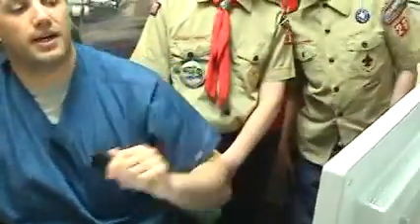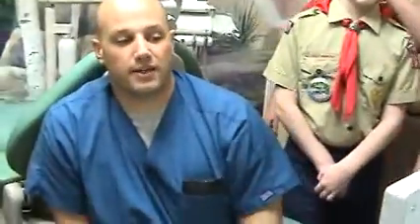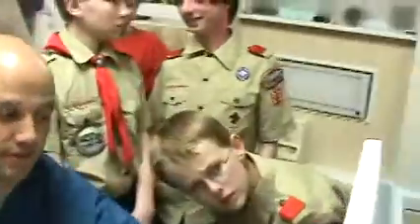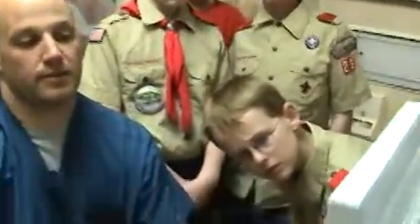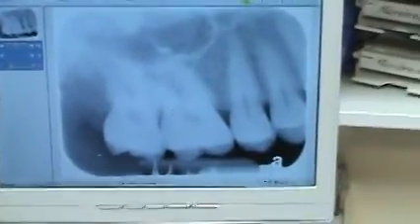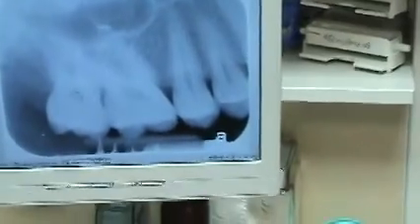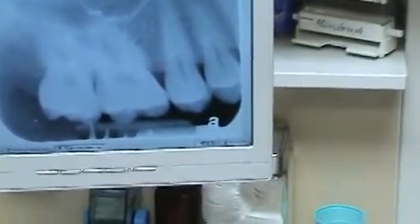Kathy, did you pull that up so it's up there? Okay. Right here, Sister Anderson was kind enough to pull up her personal radiographs. So right here is a digital representation of her radiographs. I'm going to sneak past you guys so I can film this here. I can make this a full screen picture, and this is a picture of her upper right hand side. And on this you can see a lot of different things.